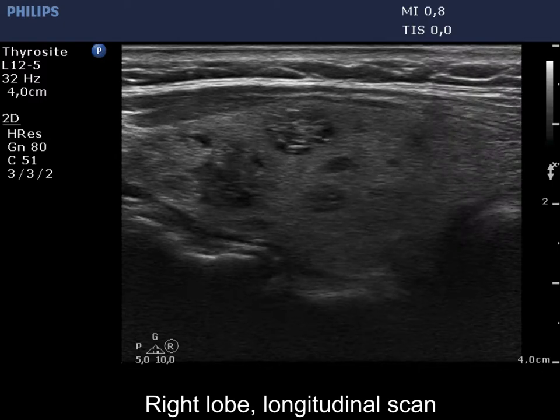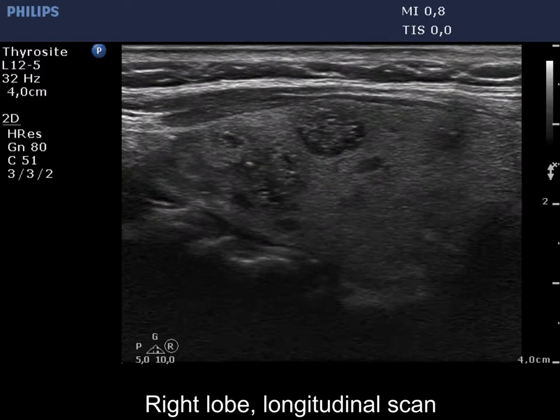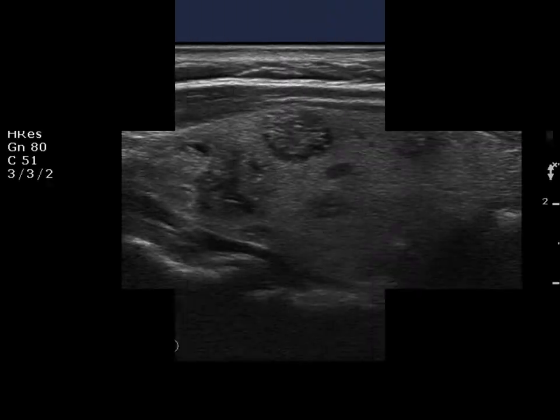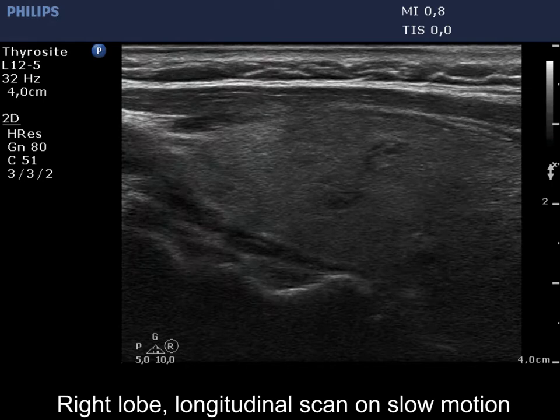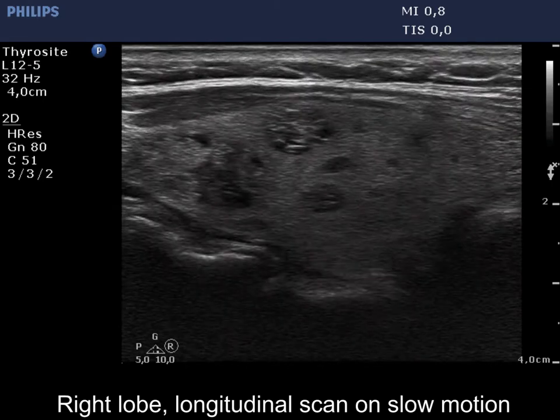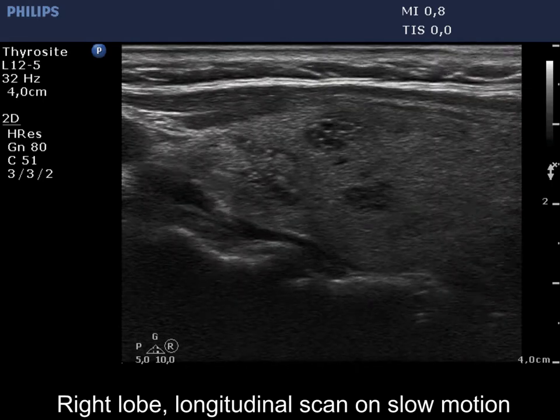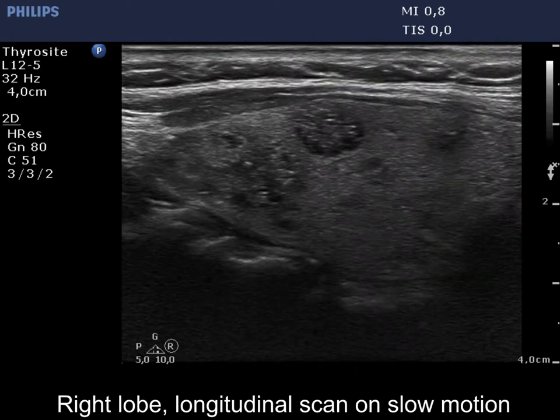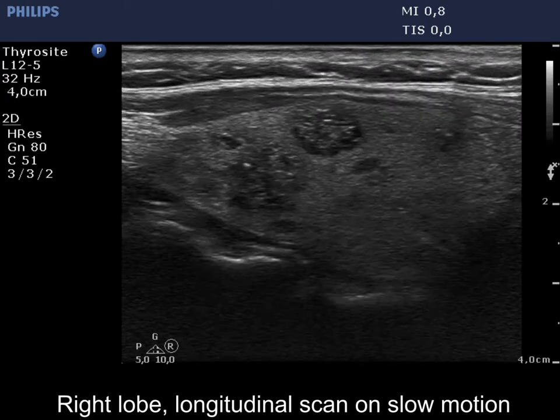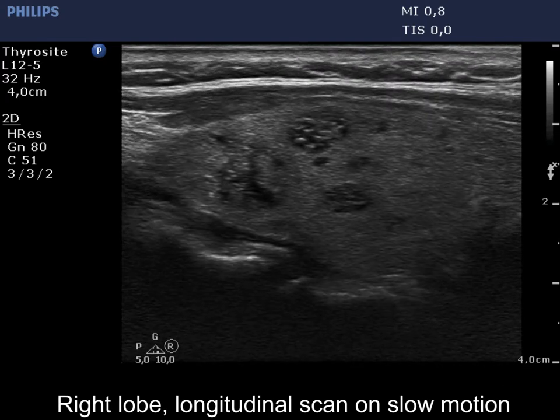Let me focus on the nodule in the upper pole. The upper borders of the lesion are undefined. However, this is not a pathological blur, but caused simply by the similarly isoechoic pattern of the upper part of the nodule and the surrounding parenchyma.